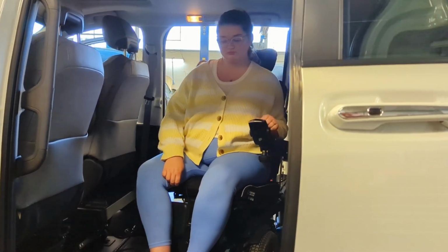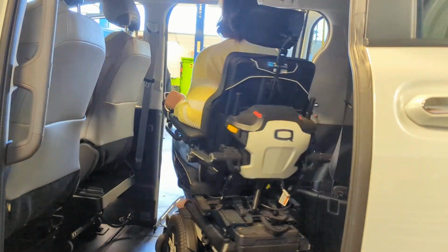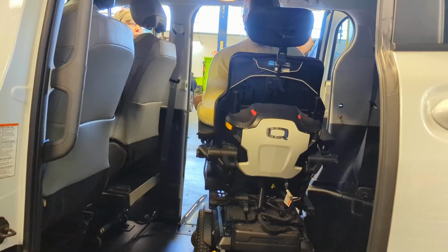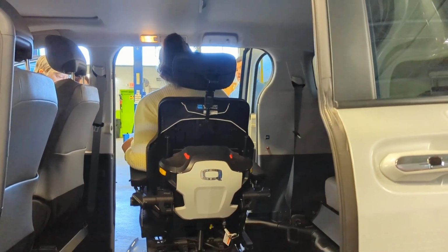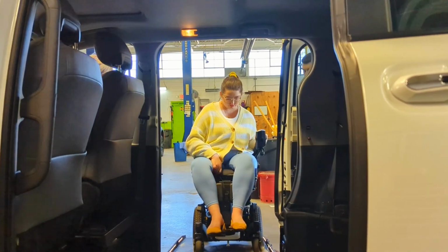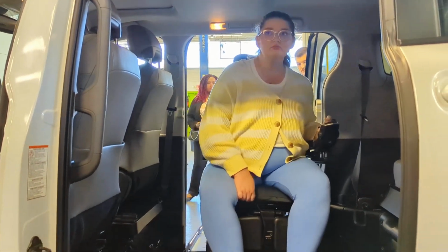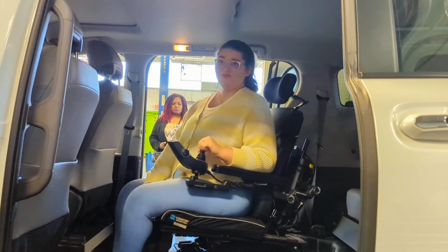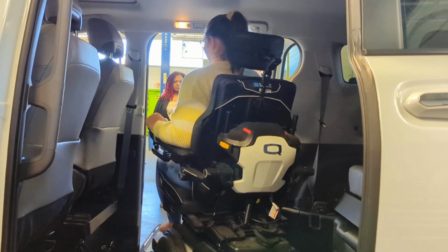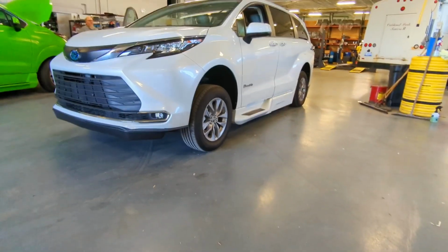Here you are seeing footage of me testing out the pin and lock bracket system that I had been fitted for a few days earlier. My chair is locked into place now, and when I push that red button, it unlocks and I can drive freely out of the van. I am testing my aim for the pin. You can kind of see it on the bottom of my chair. It's a little violent when it locks into place, but that's what they told me to do. And with my chair locked in place, I can spin around basically 360 and my chair will be secure while driving. Here is what the van looks like from the outside.